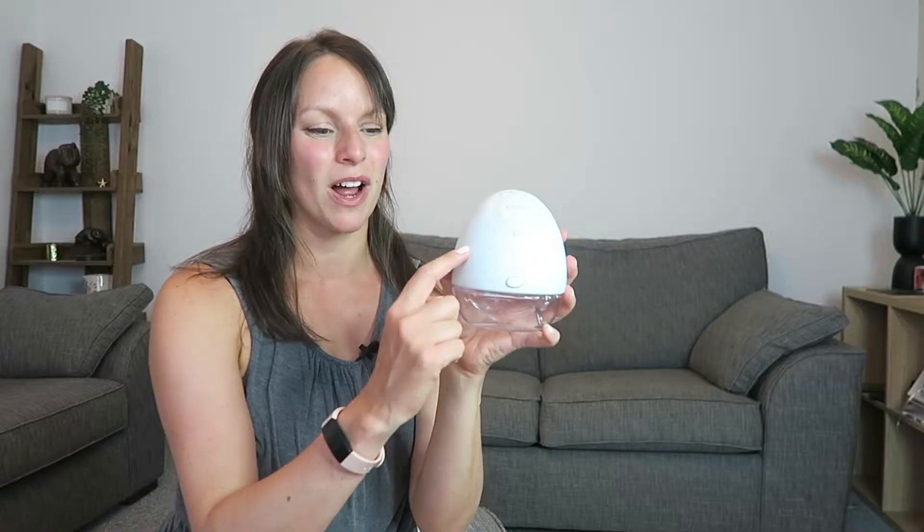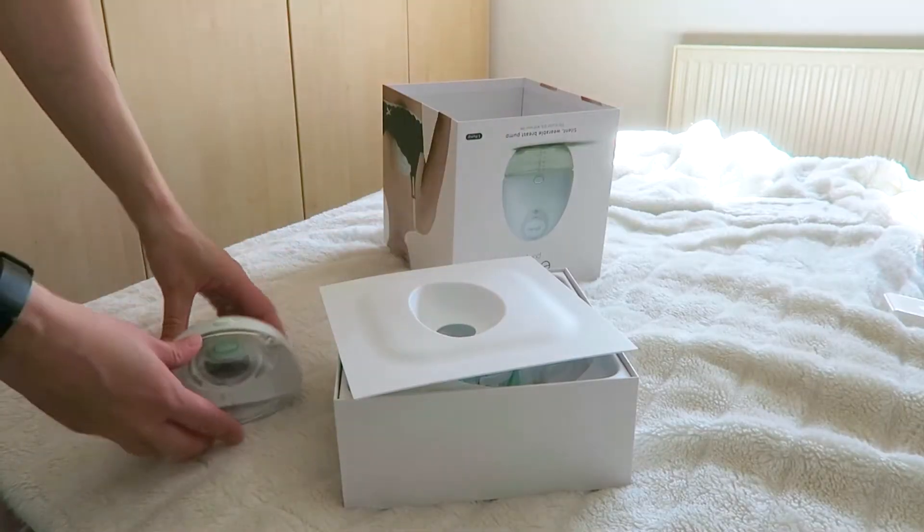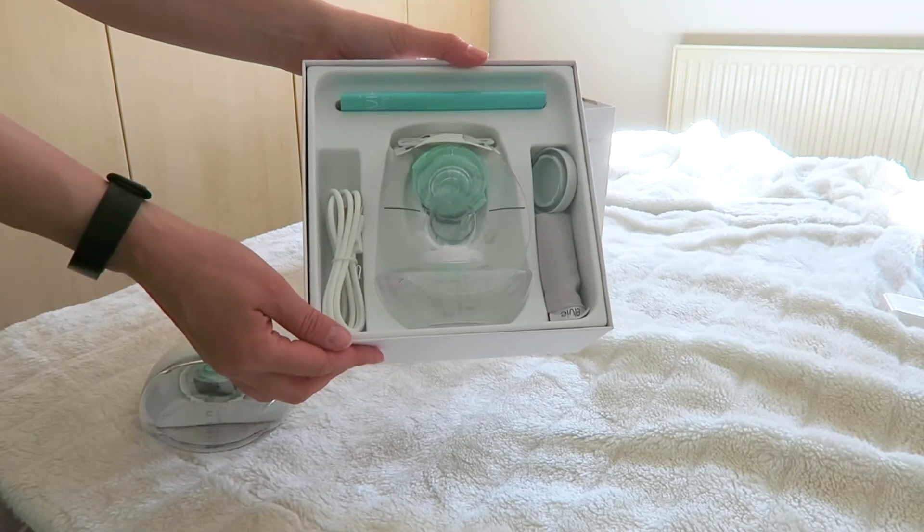So if you just buy the one, which is what I did, you get one of these units, but you get kind of two of everything else. So you can only use one at a time of these ones, but you can start to sterilize some of the other stuff.